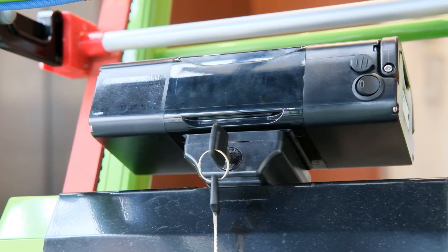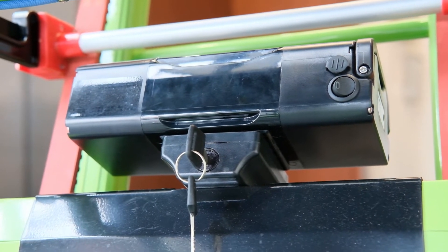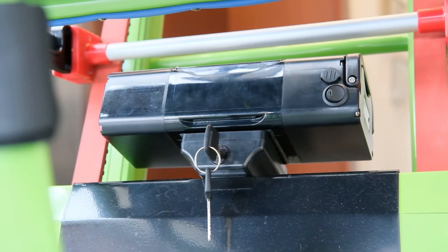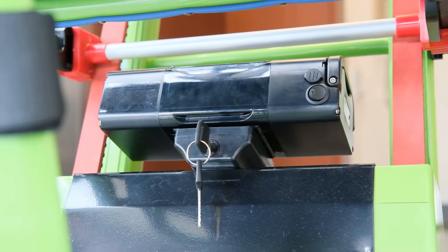It is now ready for use. It is recommended to remove one of the two supplied keys and keep it in a safe place. When not in use, the battery charge will dissipate over an 8 to 10 week period. If you do not keep it plugged in, be sure to recharge the battery one to two times per month.